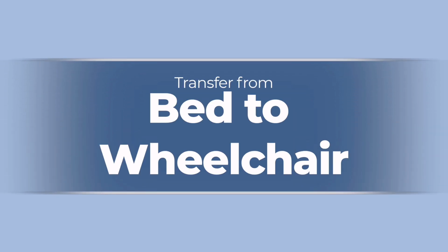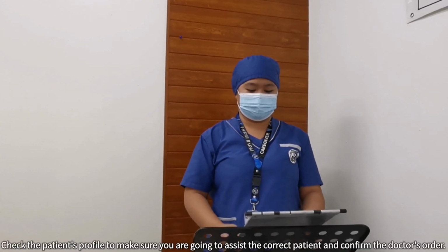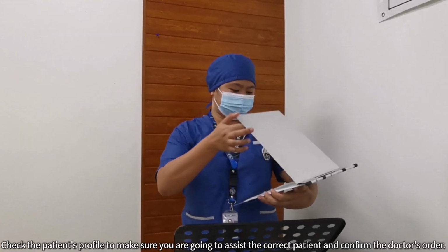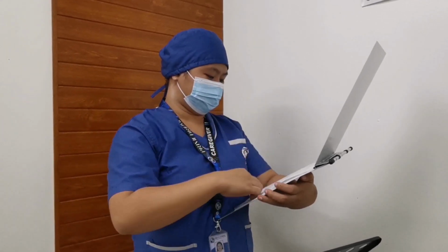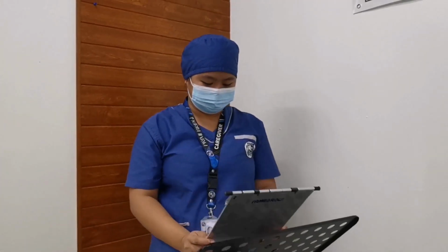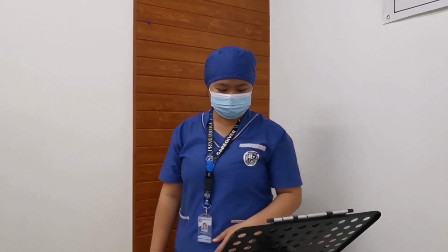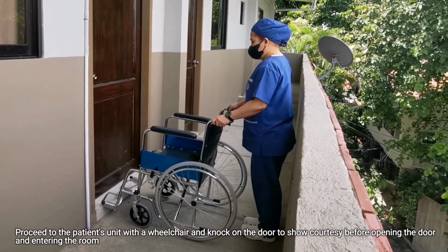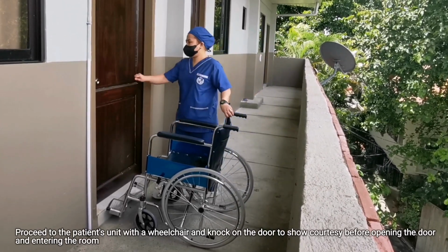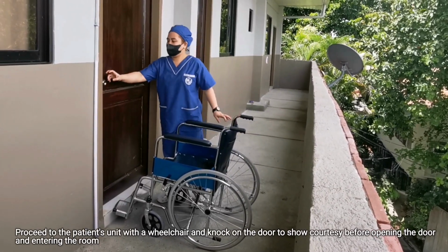Transfer from bed to wheelchair. Check the patient's profile to make sure you are going to assist the correct patient and confirm the doctor's order. Proceed to the patient's unit with the wheelchair and knock on the door to show courtesy before opening the door and entering the room.